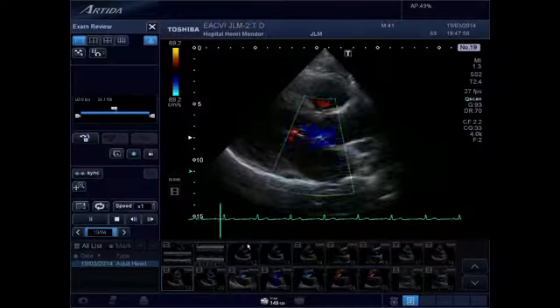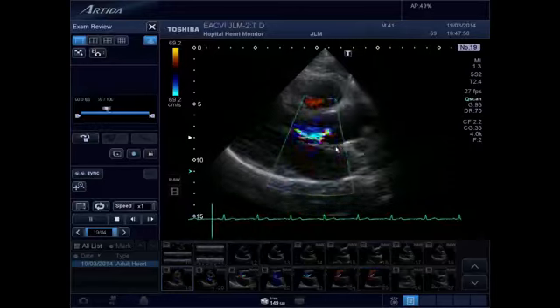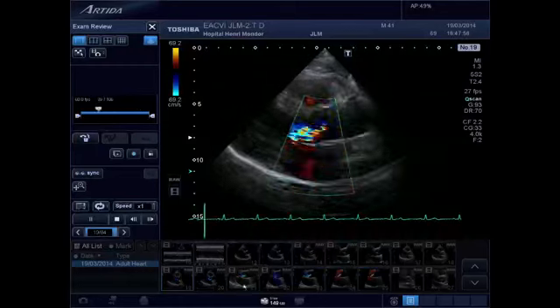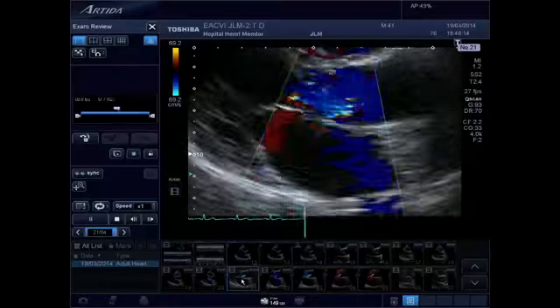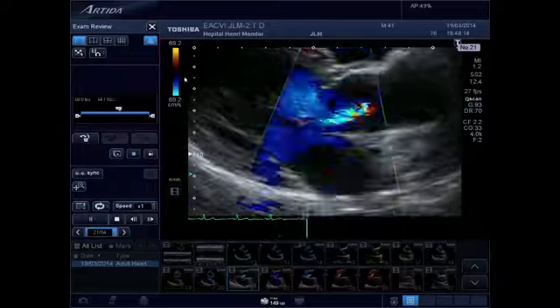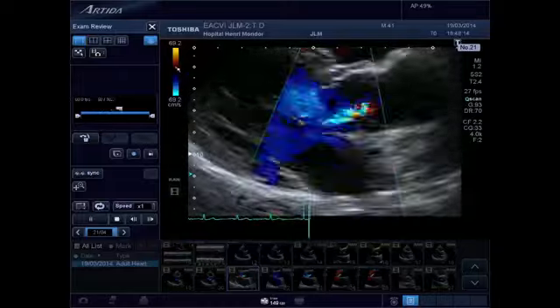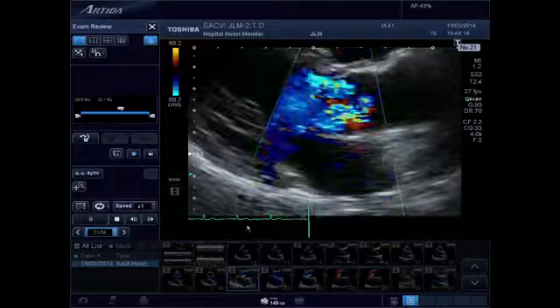Now we will use the color Doppler flow to image the fact that this young patient has an aortic regurgitation, which seems moderate at first sight. We will zoom on the left ventricular outflow tract, and the Nyquist limit is between 0.6 and 0.7 meter per second with a symmetric baseline in order to measure the vena contracta.